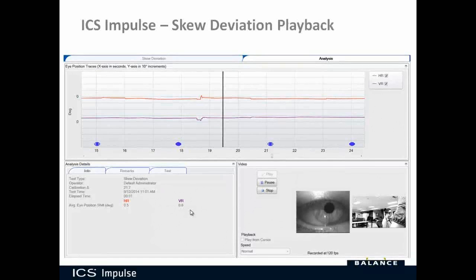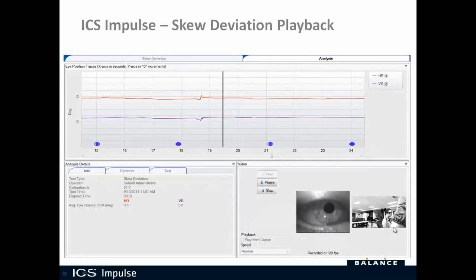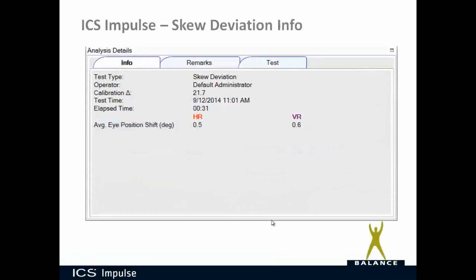You can play back the trace, the eye video, and the room video all together, either at normal speed or in slow motion. In the Info tab you have the test type — it says skew deviation — the operator, the calibration, the test date and time, how long the test took (the elapsed time), and the average eye position shift in degrees.